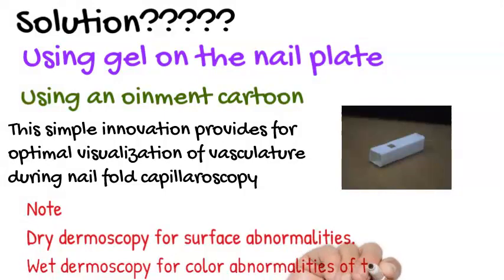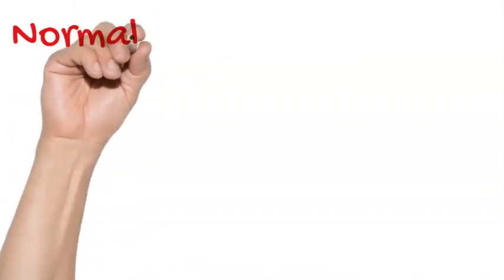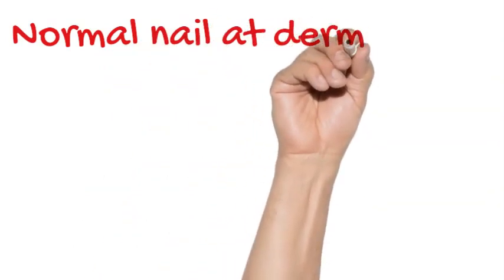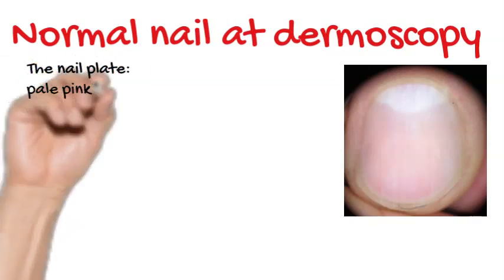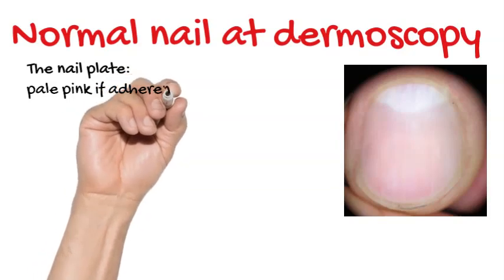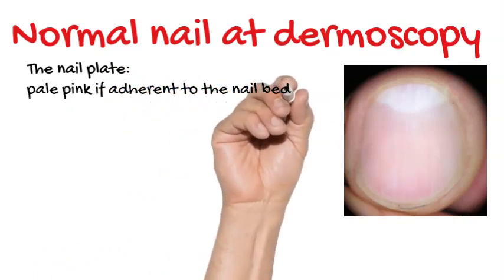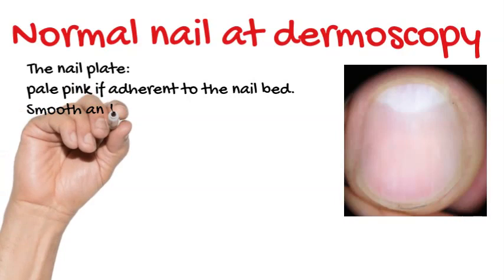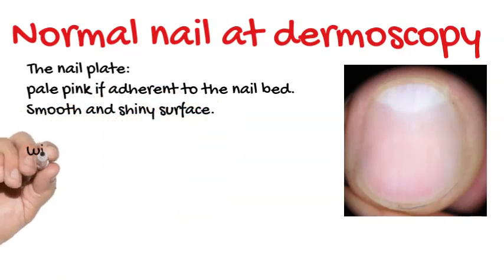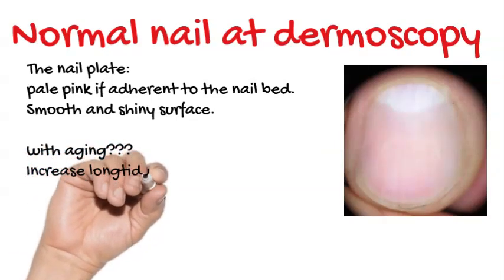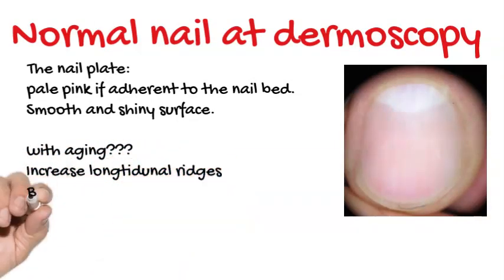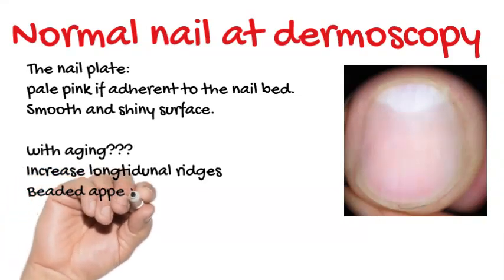Regarding the normal nail at dermoscopy, we must examine the nail plate. It will appear as pale pink if adherent to the nail bed, with a smooth and shiny surface. With aging, there is an increase in longitudinal ridges and a beaded appearance.